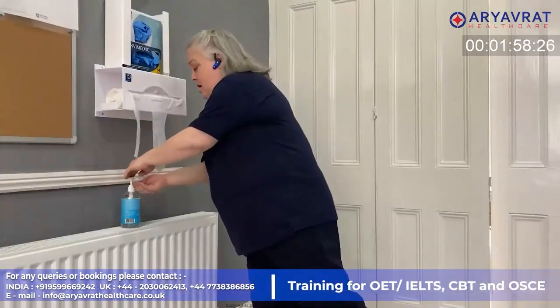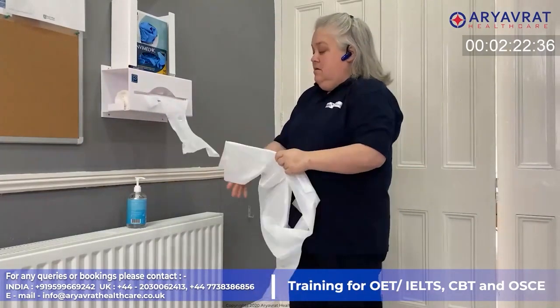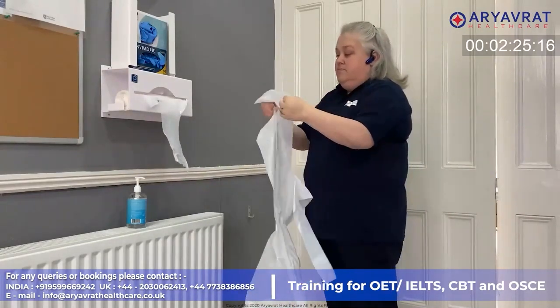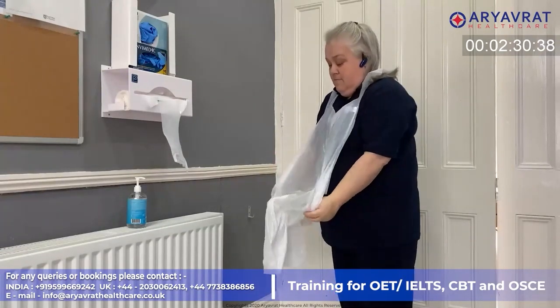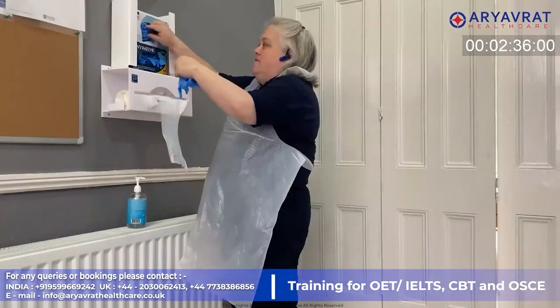Okay. So I'm going to do my hand hygiene. If there was a sink available, I would do a full soap and water wash, but as not, I'm going to use a hand gel just to make sure my hands are clean before grabbing my apron and a pair of gloves.